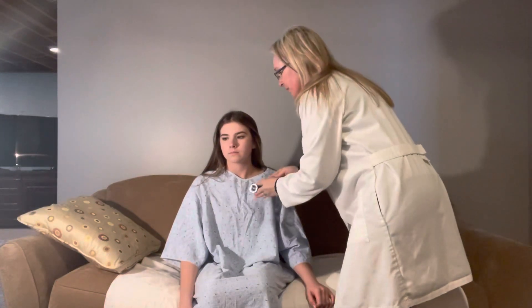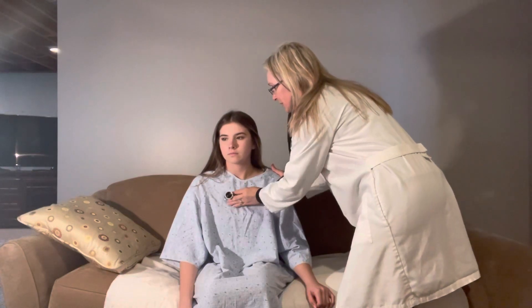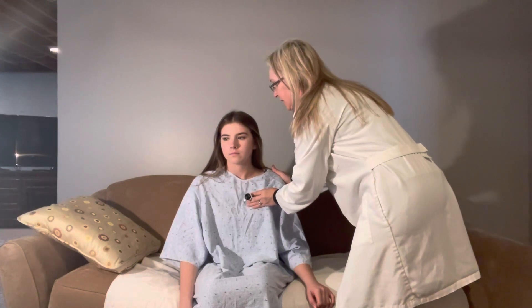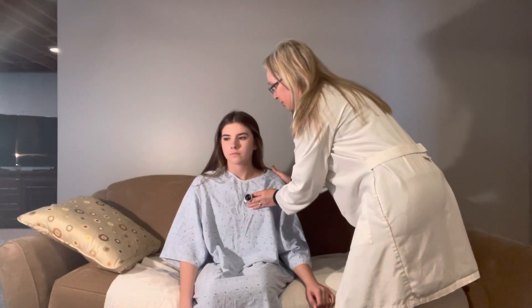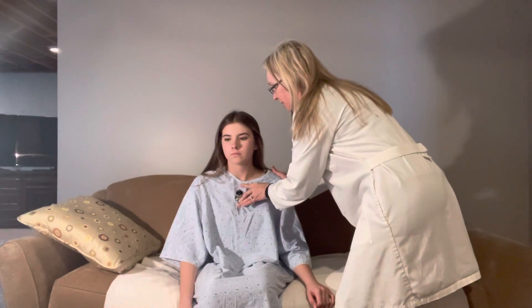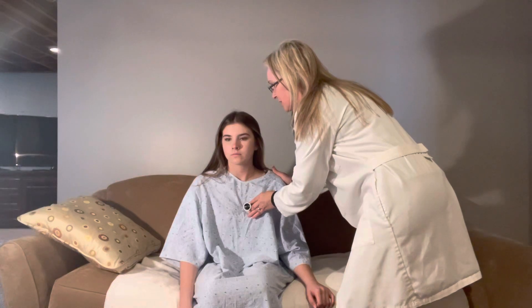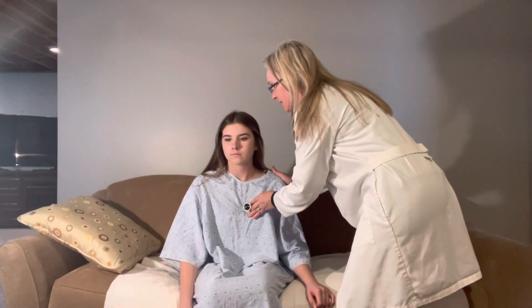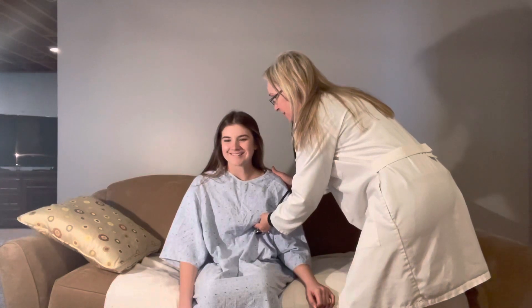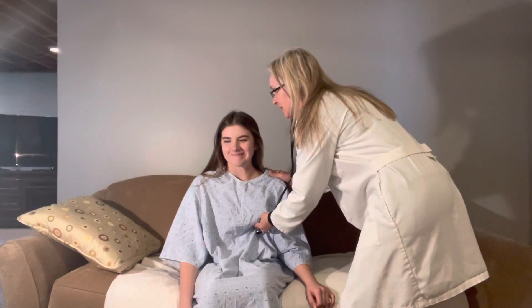I'm going to take a listen to your heart at the second intercostal space, right sternal border, second intercostal space, left sternal border. This is your sternum here — you have your manubrium, your angle, your third intercostal space, which is Erb's point — and listen for your mitral valve, which is at the fifth intercostal space, mid-clavicular line.